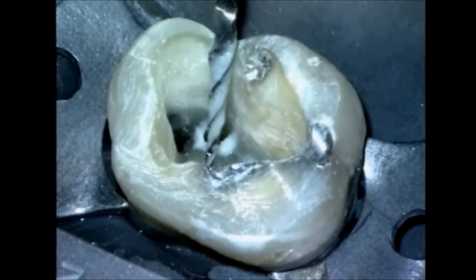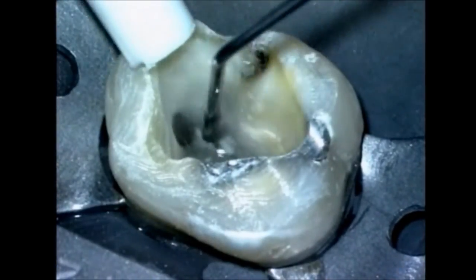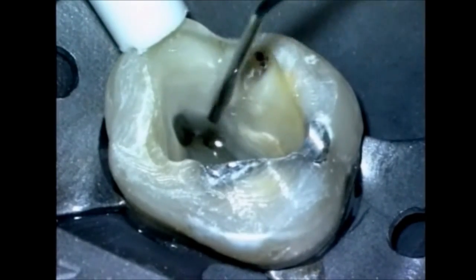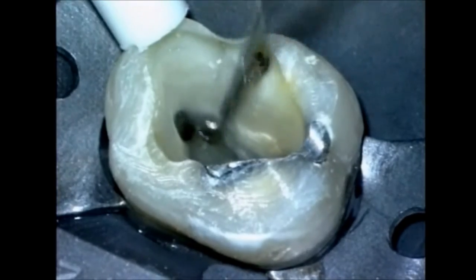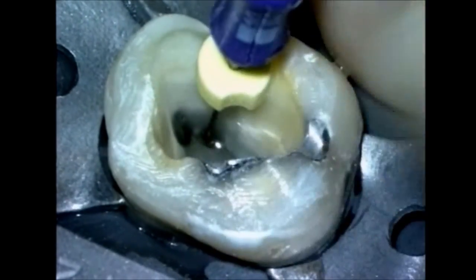To clear the debris off the blades, the assistant steadies the hand and plunges the sponge to clear the blades. Shaper X generates an enormous amount of debris, so it's important to irrigate, recapitulate, and re-irrigate. As we've used Shaper 1 and Shaper X, the optimal shape has been cut in the upper 2/3 of the root canal space. Now we can scout the rest of the canal.